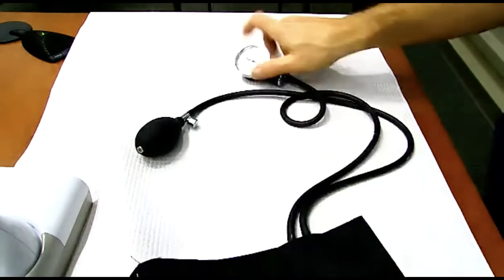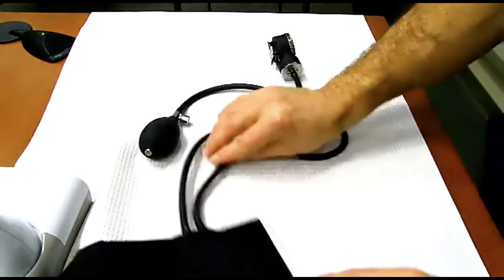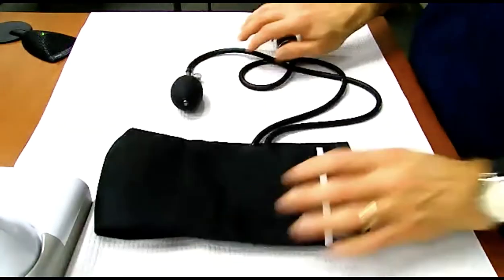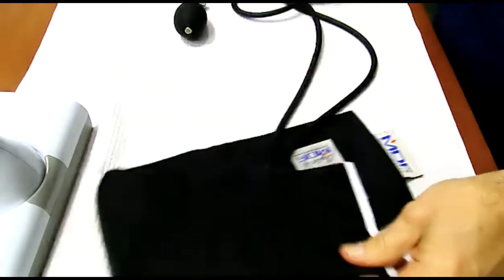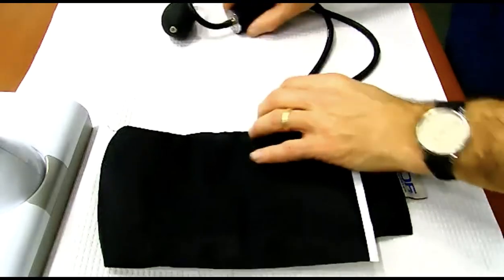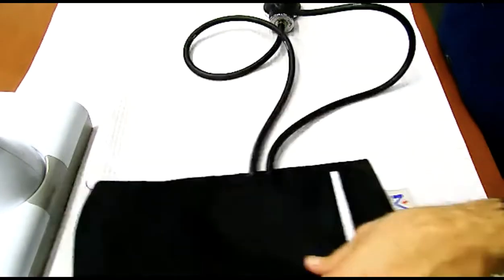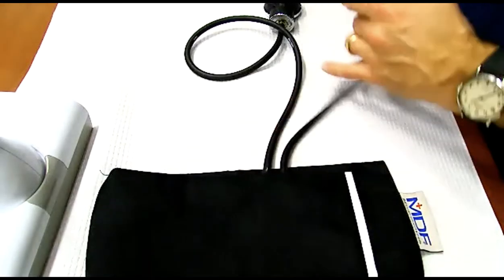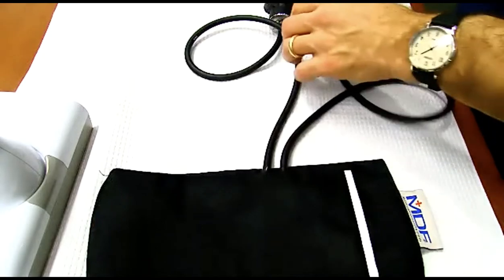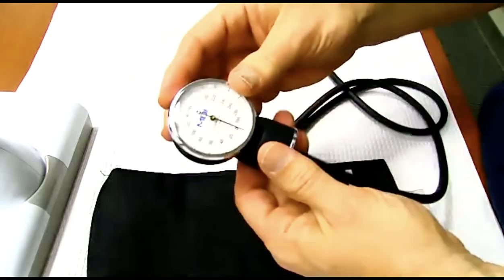So the first thing we're going to do, you've got the cuff here. You'll notice there are two hoses that come out of the cuff. It does not matter what you connect to what. I try to match mine to what they had on their website, but it really doesn't matter. Essentially, what's in here is the bladder that has two hoses for the air. To one of the hoses, we'll start here with the manometer. This is the pressure gauge, or the manometer.